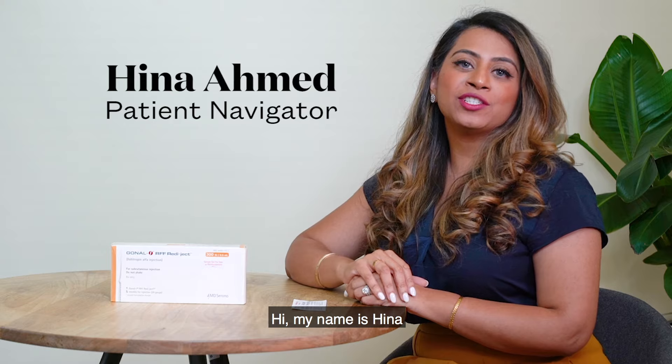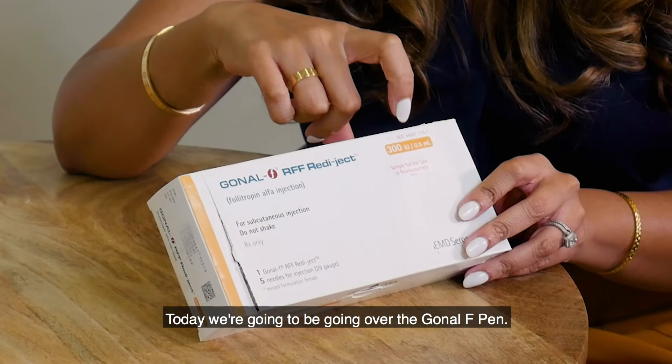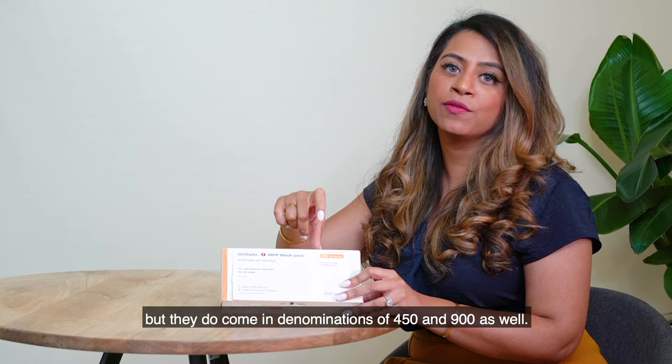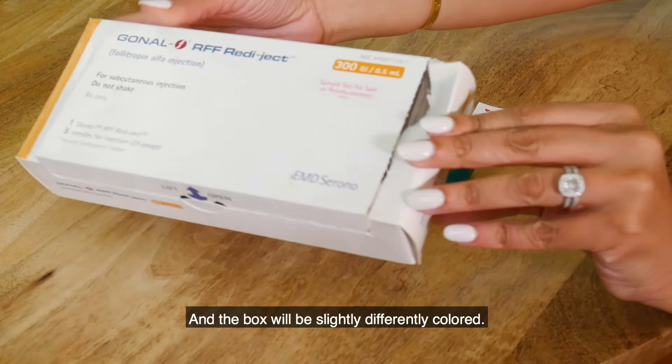Hi, my name is Hina and I'm the patient navigator at KindBody. Today we're going to be going over the Gonal-F pen. Each pen has a different denomination — this one happens to be 300, but they do come in denominations of 450 and 900 as well, and the box will be slightly differently colored.